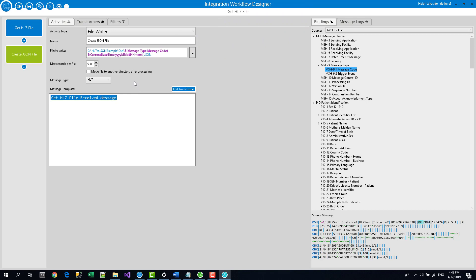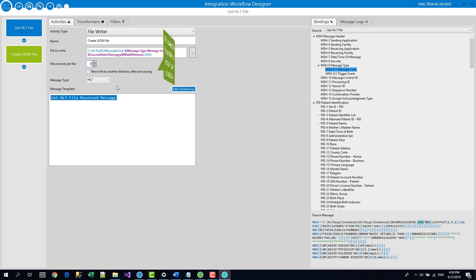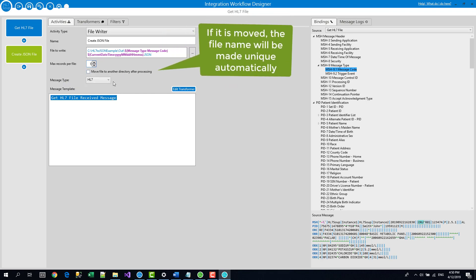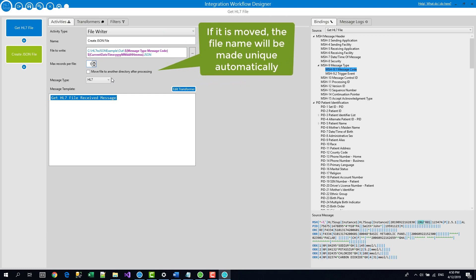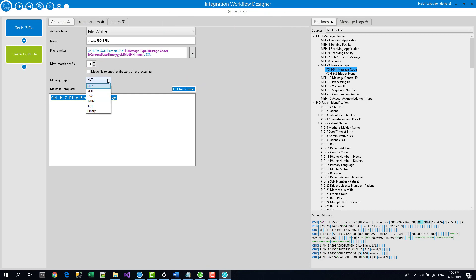Okay, so we've got our file name created and now the maximum records per file. Now this is a JSON file so you just change that to one. You're going to have a unique file for each record that we write out. Do we need to write it to move it to another directory after processing? No. Again, that's if you have some sort of blocking issues.